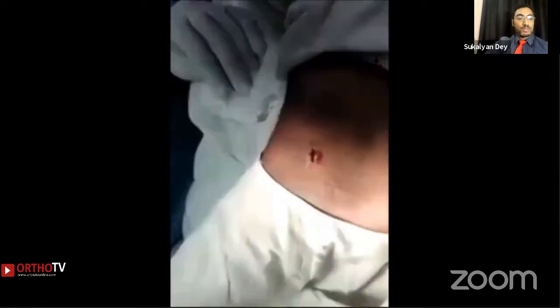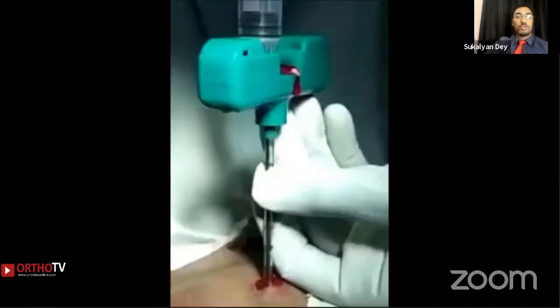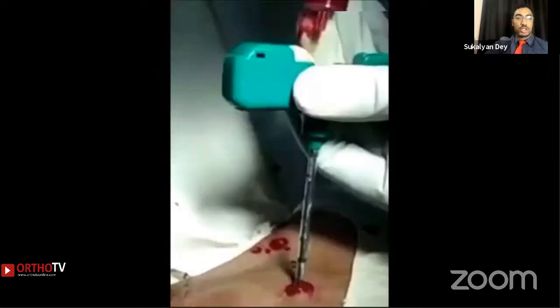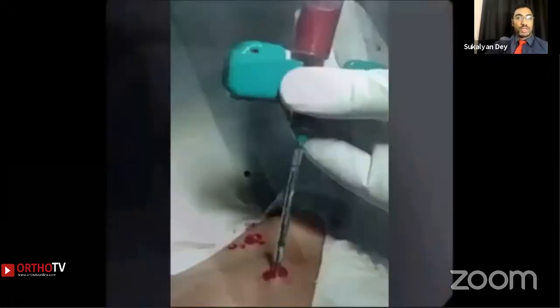This is the actual procedure in action. The insertion of the needle may require a small stab incision. The needle may be used to scrape the cyst wall while taking care not to widen the hole of the insertion. This scraping can accomplish what many call curopsy, that is, biopsy with an intent to cure. This aspirated fluid can be sent for histopathological examination. This is how it looks under the fluoroscopy guidance.